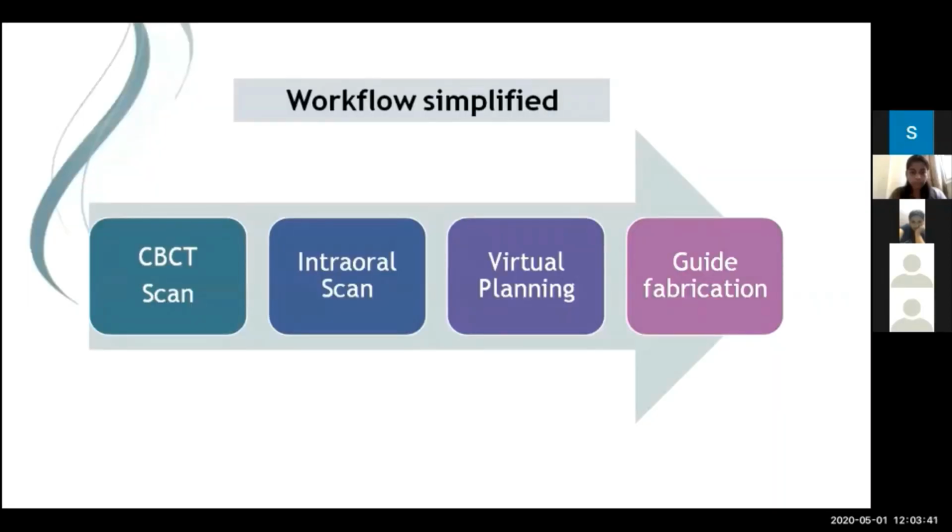So to simplify the workflow, when a patient comes to you and based on the indications, if you have taken the call as an implantologist to utilize a 3D printed surgical guide, the first step after clinical examination would be to obtain a CBCT scan. The second step would be to obtain an intraoral scan using an intraoral scanner.